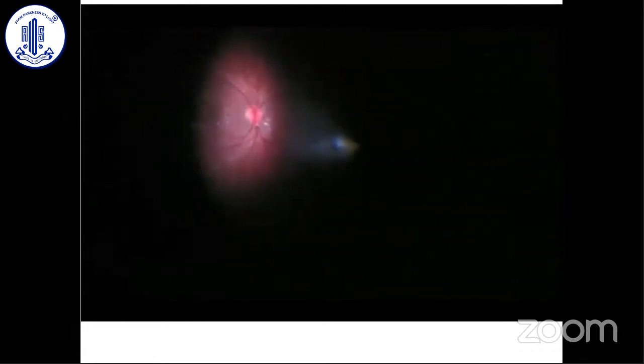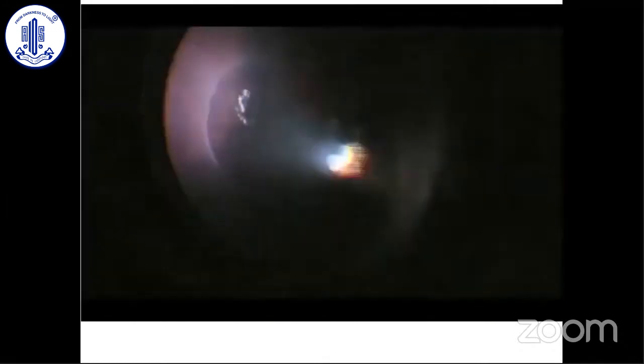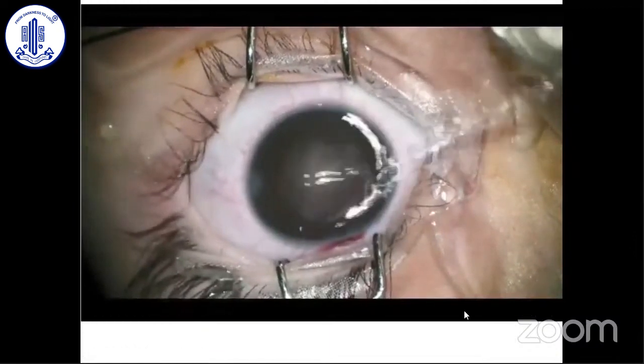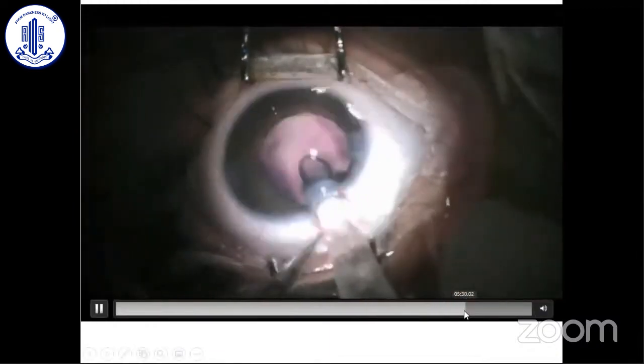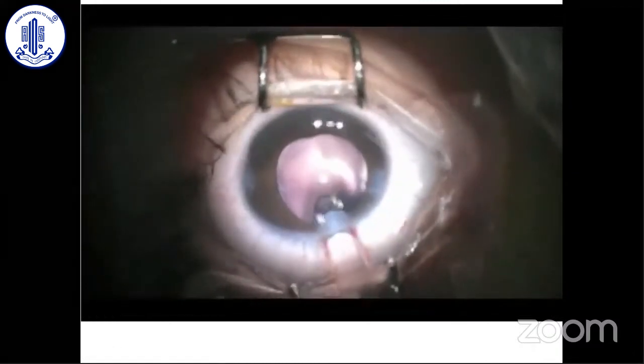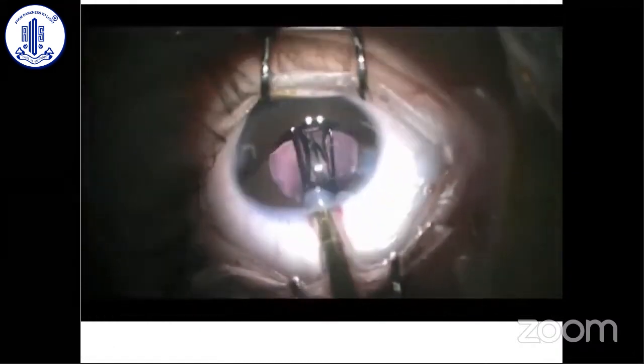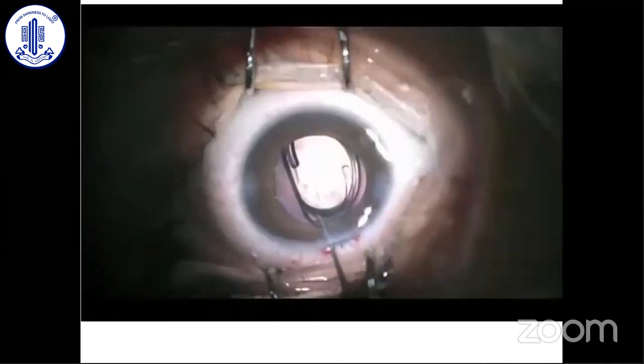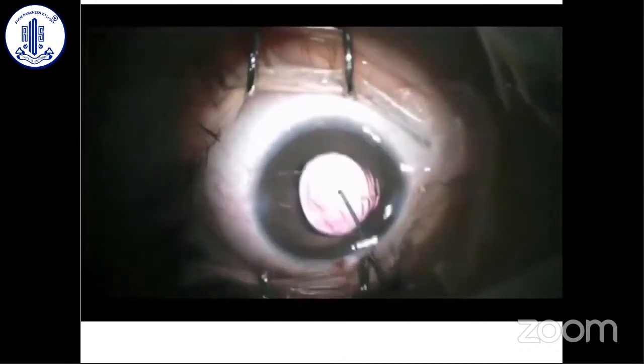We have published a paper on this in BMJ — we reviewed about 500 patients and could pick up a whole gamut of findings, including disc cupping. I can share the files with you if time allows. The lens goes into the bag as a single-piece IOL because both anterior and posterior rhexes are intact, so the lens will stay in the bag. Then put a stromal hydration under the main incision, hydrate the side incision, and the lens stays put in the eye.